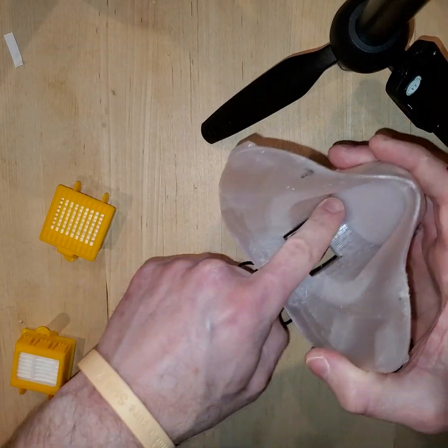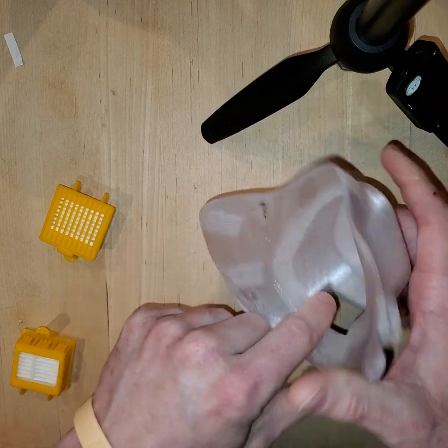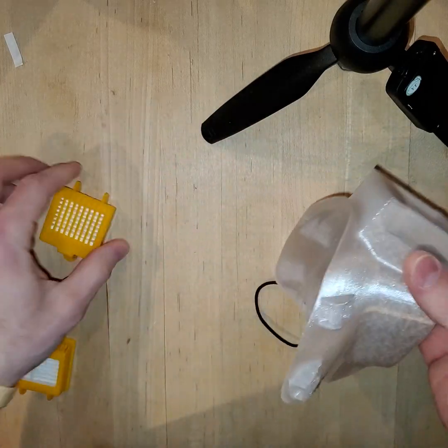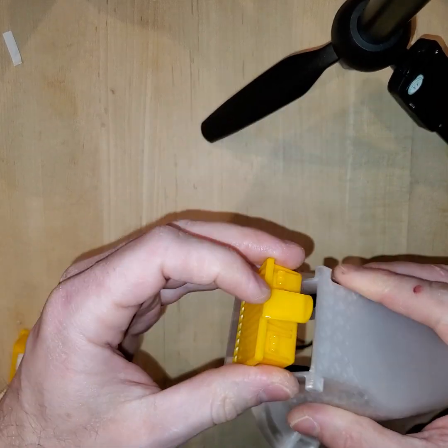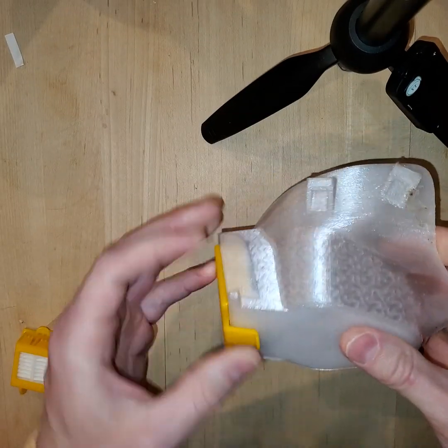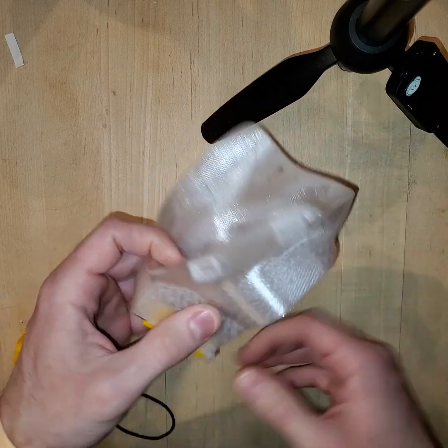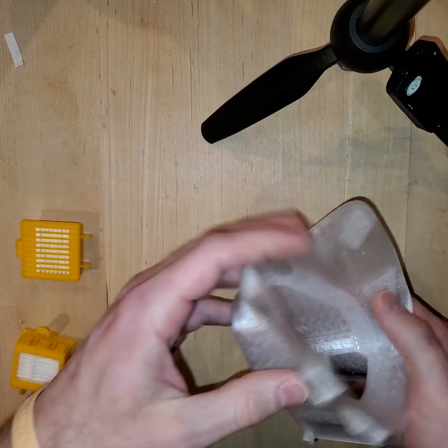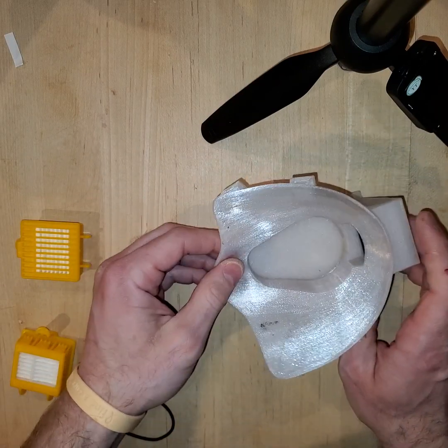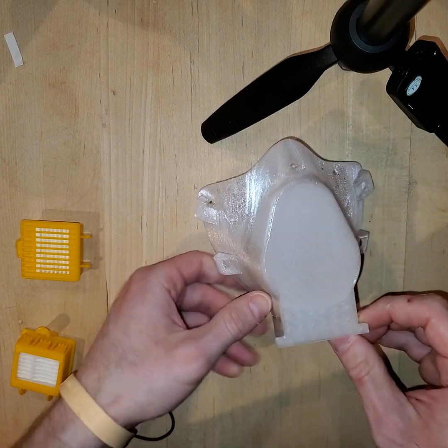I designed it, as best as I could, to be easy to access and easy to clean, so you can clean it all out, decontaminate, and then use a new filter. So I think it's all pretty well self-contained. I printed this entirely without supports. That's the reason I got the burn marks. So just be aware, you can print this, at least on FDM, without supports. I'm not so sure about SLA or resin printing, but anyway, I think that's about it.